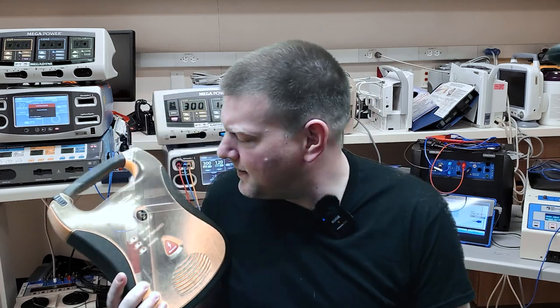Have you ever wondered what's going on inside an AED? I know I've been pretty curious myself. Let's go ahead and take a look.